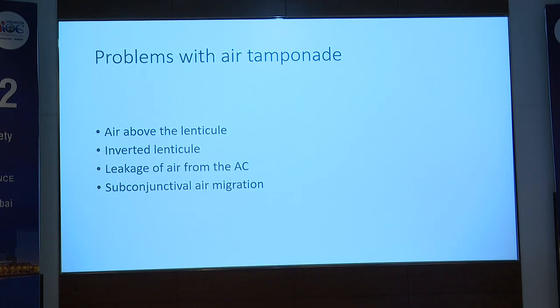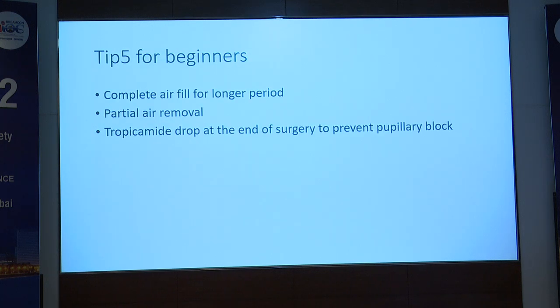And don't try to overfill the eye, because otherwise sometimes you see subconjunctival air migration also. So have a complete air fill, and partial removal of air. At the end of the surgery, you can put the dilating drop to prevent pupillary block in these patients.